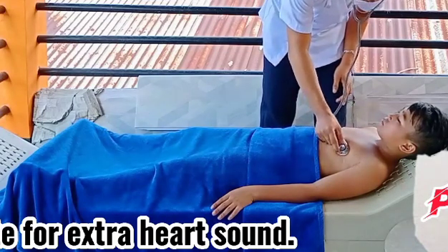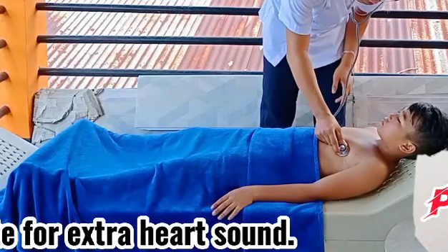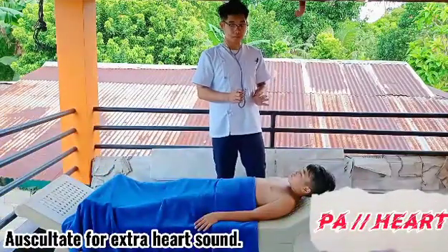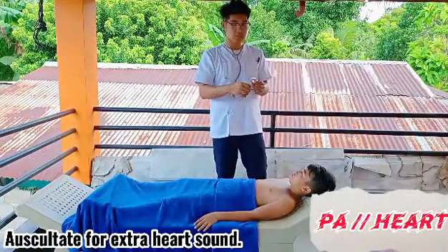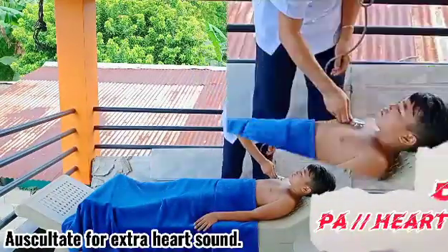And the mitral area. And we are going to repeat this process using the bell of the stethoscope.